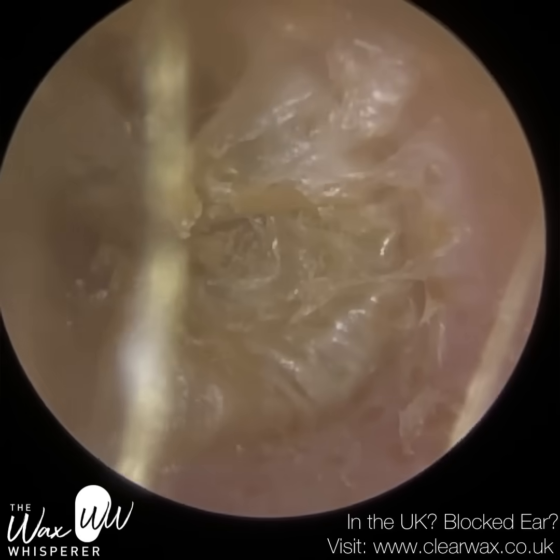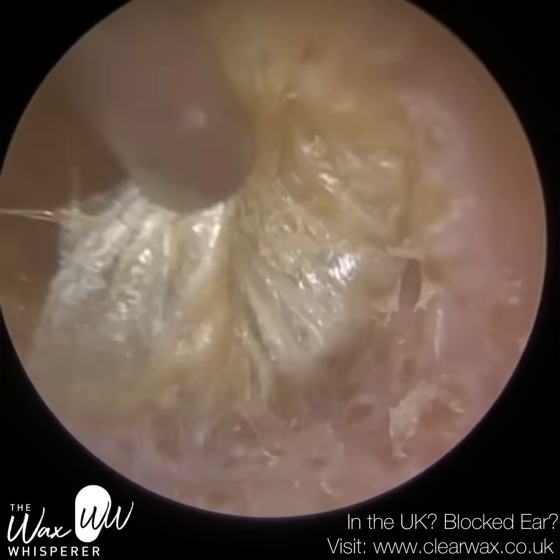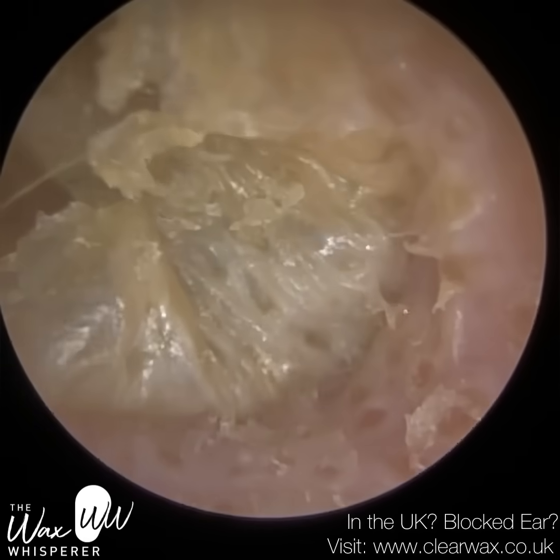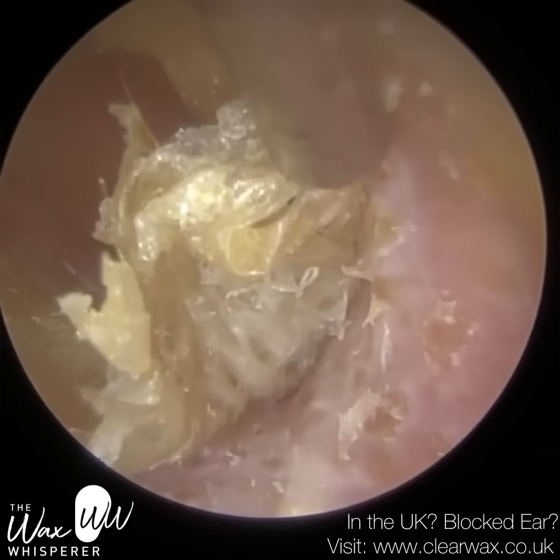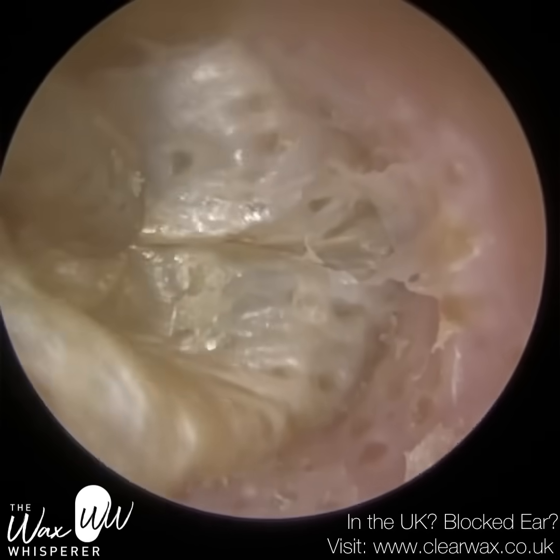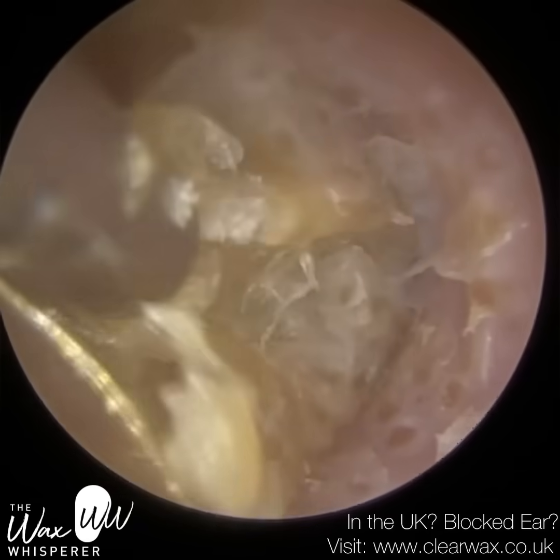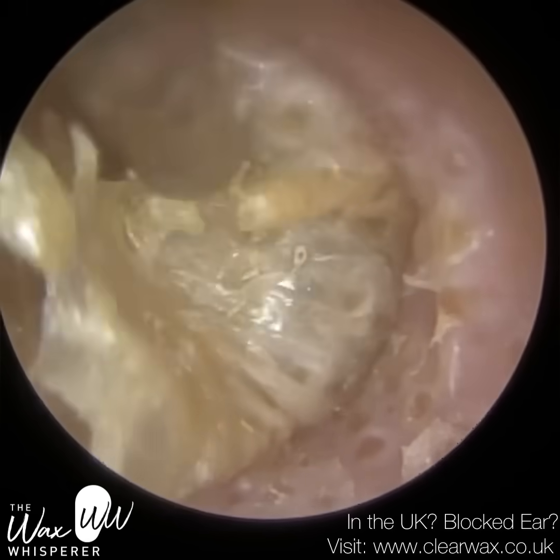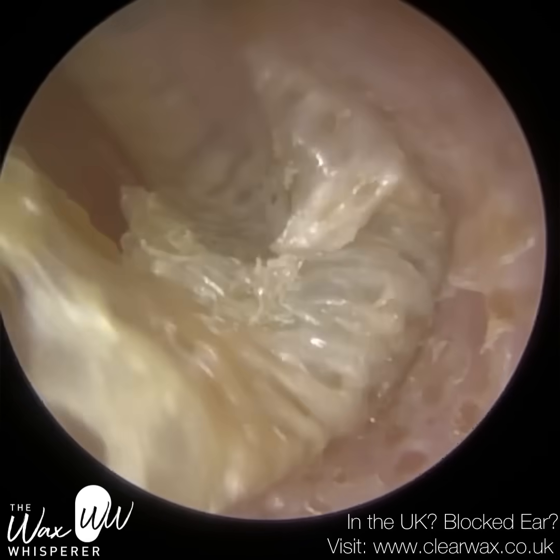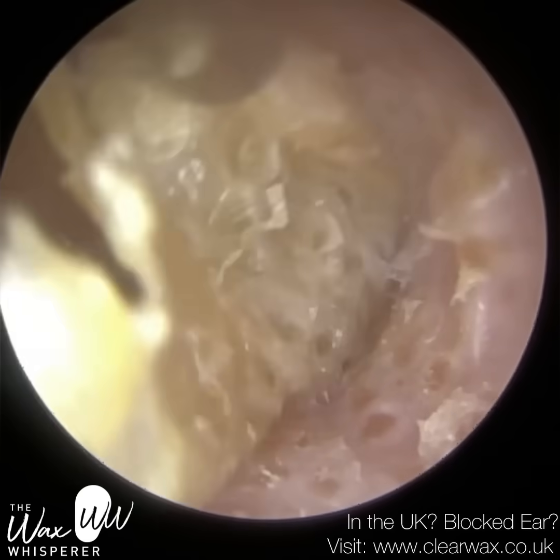They had been using some antifungal solution in the ear, which had crystallized the skin. It's not very often where the hair on the back of my neck stands up, but here it did. You can probably see why — the way the skin is crystallized, it's almost like in the shower you get the slip-proof mats with these bubbles underneath the suction cups.